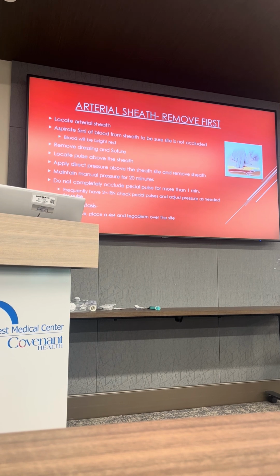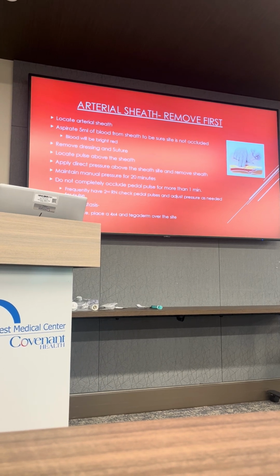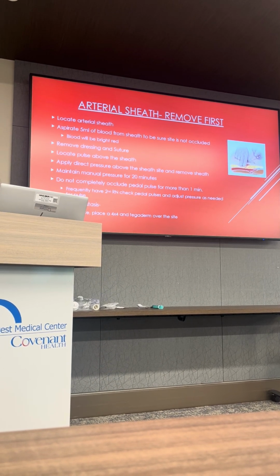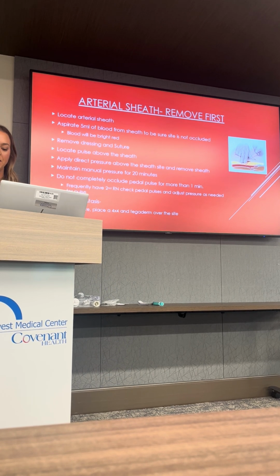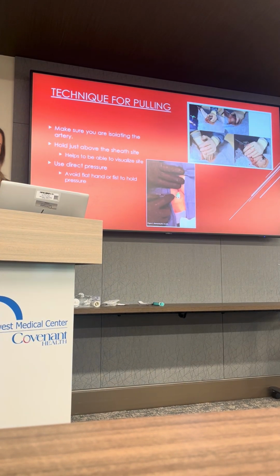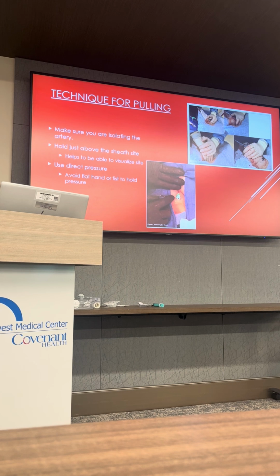In this setting, as well as whenever, I go ahead and throw on a Thrombix, especially with an arterial access. Venous, I'm not necessarily as concerned, but I think it's a good rule of practice to go ahead and throw on a Thrombix. It's not going to hurt anything, but it certainly is going to help some things. So again, this goes over the technique for pulling sheaths, holding pressure, and things like that. Obviously you can see some with these pictures, but it's like what we've talked about.